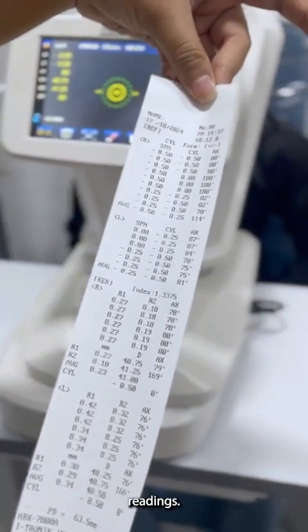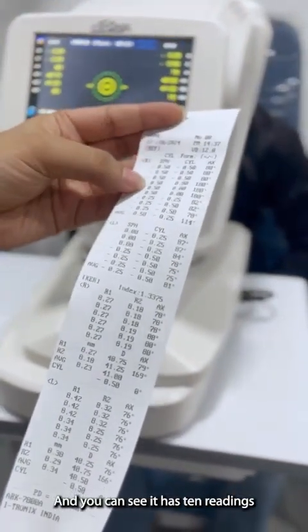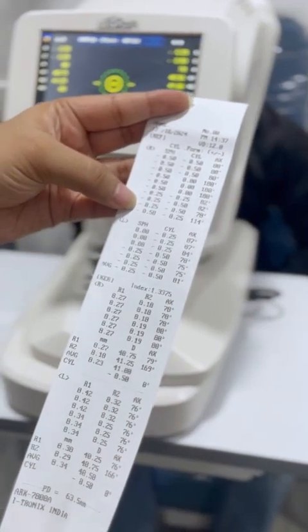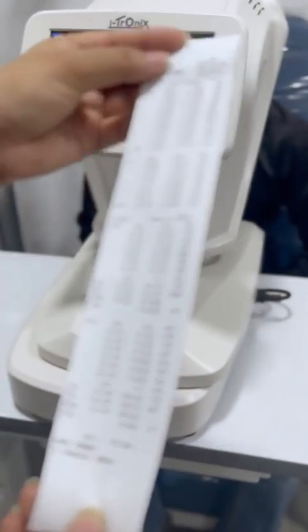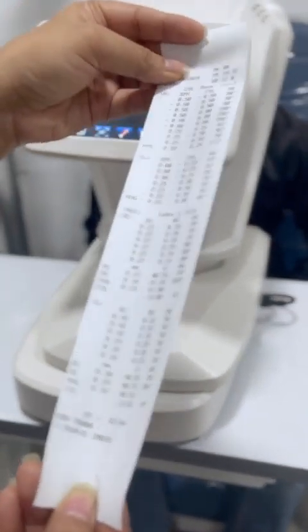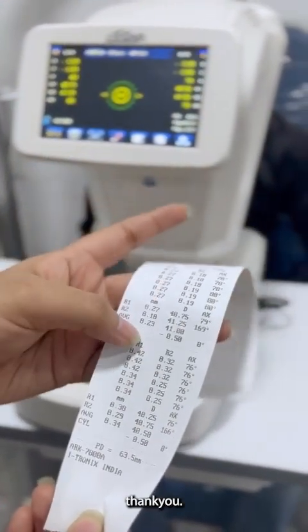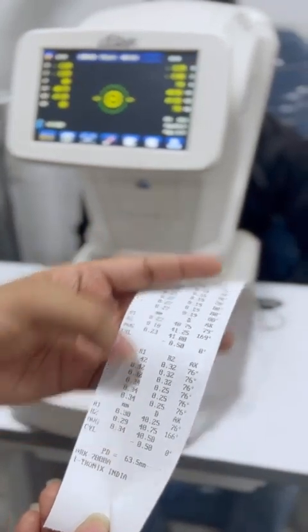And these are the readings. As you can see, it has taken 10 readings, and also K readings as well.